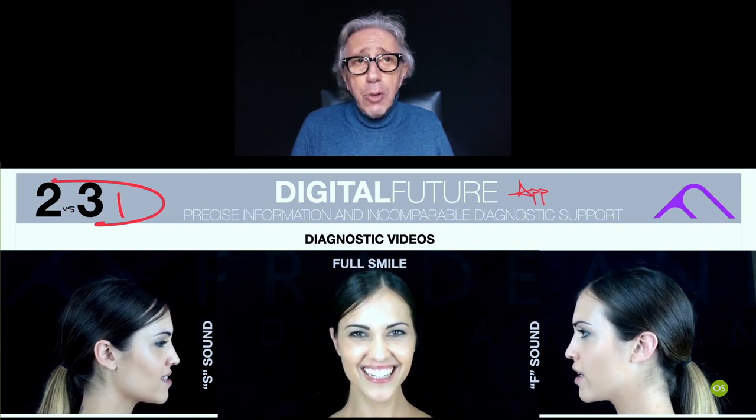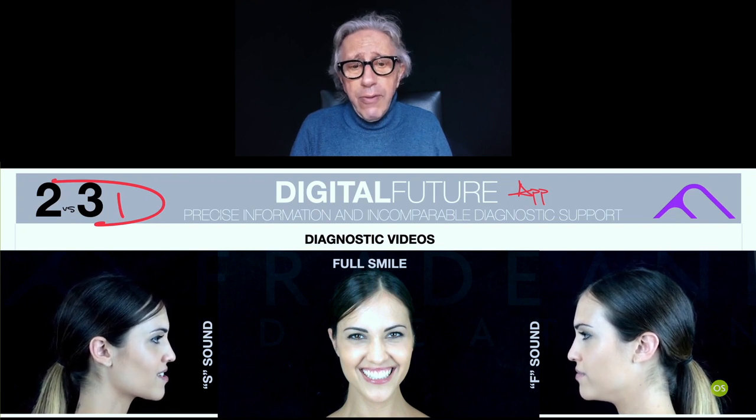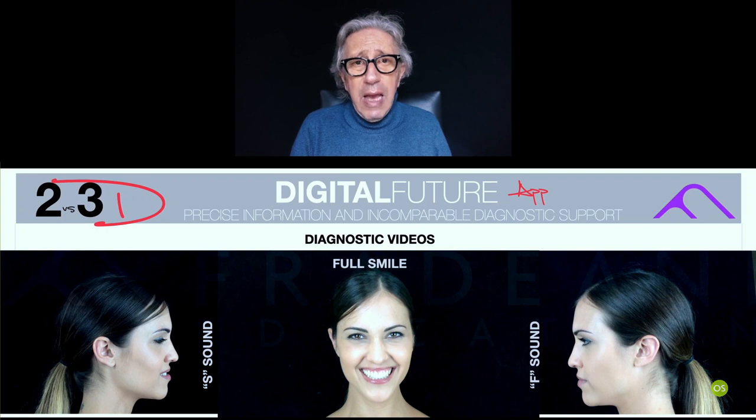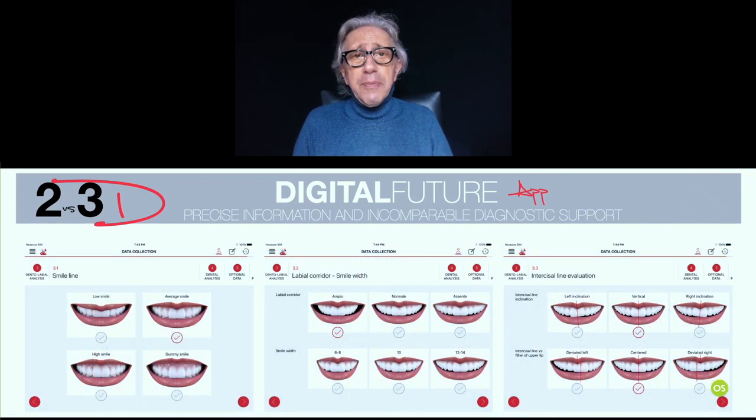Of course, knowing that the picture is a static moment of a dynamic action, we love to have videos. Very important for many steps, for the smile, for the sounds, the F sound, the S sound. So it's very useful to combine videos with the picture. Then you can judge all the information from other parameters, like the smile line of the patient, labial corridor, interincisal line versus the middle line of the face of the patient, and many other things.